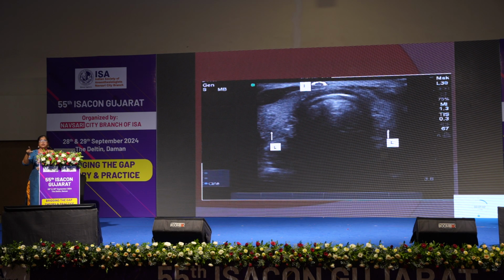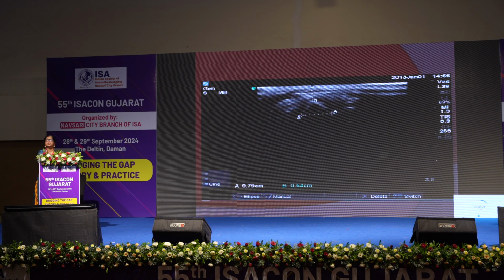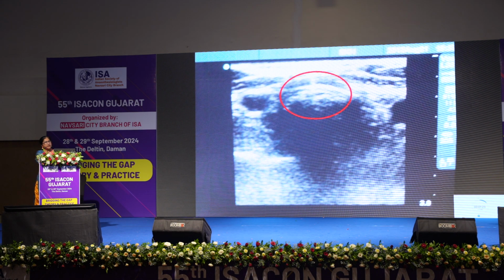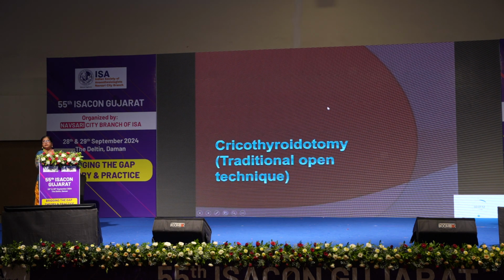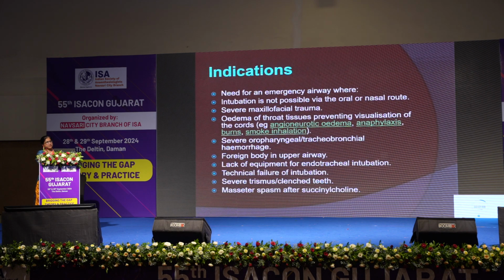Now ultrasound also helps you to see the width of the thyroid gland, so that you unnecessarily don't puncture it. Okay, and you can also see the skin to the tracheal cartilage distance. So you can have an assumption of how much needle to introduce. Right. So this is a photograph which I have taken when we were doing. You can see the shadow of the needle coming in here. Right. So it was kind of like real time also, that you can actually see the needle entering with the help of the ultrasound.